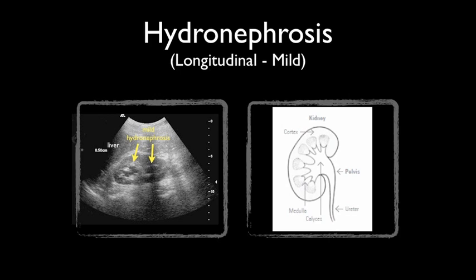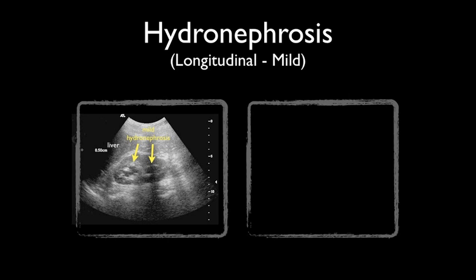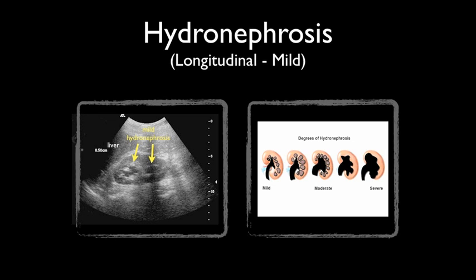Hydronephrosis is the distension and dilation of the renal pelvis and calyces, usually caused by obstruction. Untreated, it can lead to progressive atrophy of the kidney. As you can see from this renal ultrasound, the central portion — the medulla — has multiple dark areas that could be confused with cysts. But upon fanning the ultrasound probe, you can actually see these structures coalescing to form dilated calyces. Comparing this ultrasound to our cartoon rendition, you can see that the image represents mild hydronephrosis.